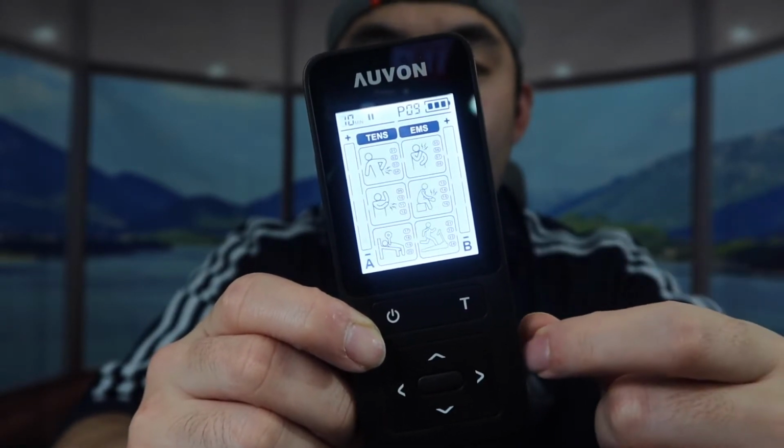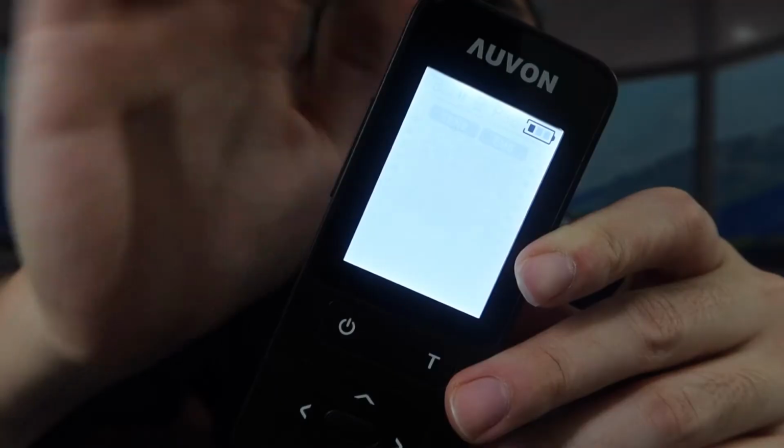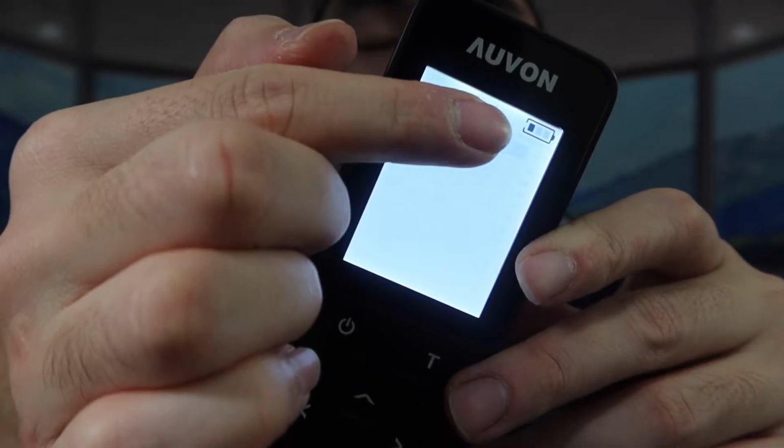But because we don't have anything plugged in right now, we can't actually use it. So before I actually test this out, let me plug in a cable to show you guys how to charge it first. So I basically want to plug in a cable in the bottom part right here. Alright, so we got it plugged in. If you can see it on the part right here, it shows you guys that it is charging.